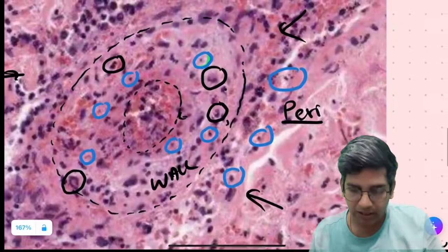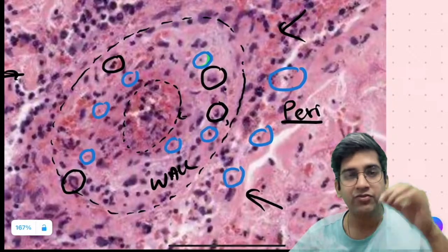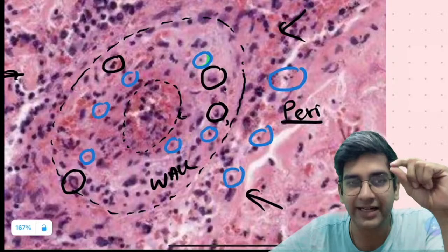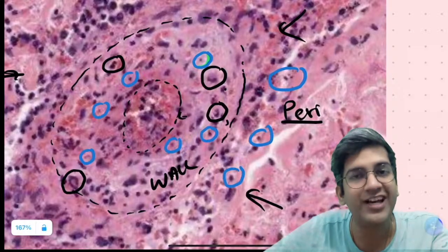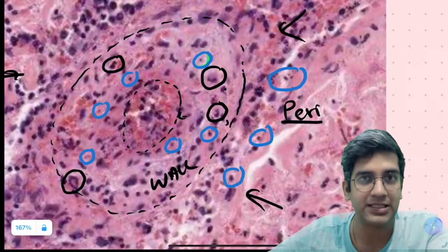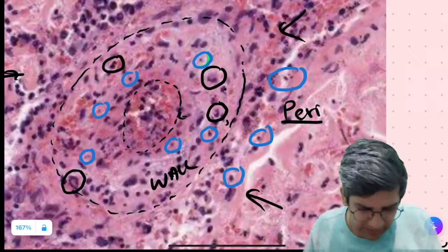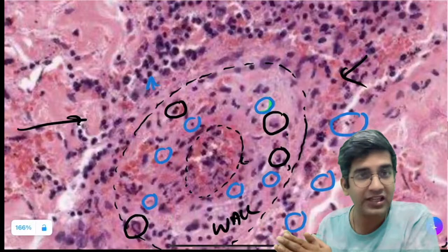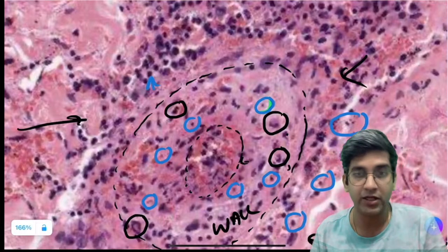Perfect, right? I won't call it a lymphocyte, Shraddha, for the only reason they are very, very, very tiny. A lymphocyte will not be this tiny, right? The only difference between a nuclear debris or a karyorrhectic debris versus a lymphocyte is its size. See this, I might go for a lymphocyte, okay? But anything smaller than that size, I'm not going to think of a lymphocyte.